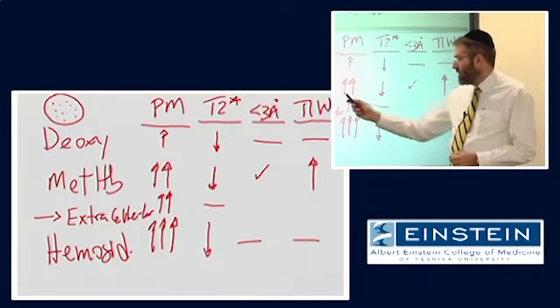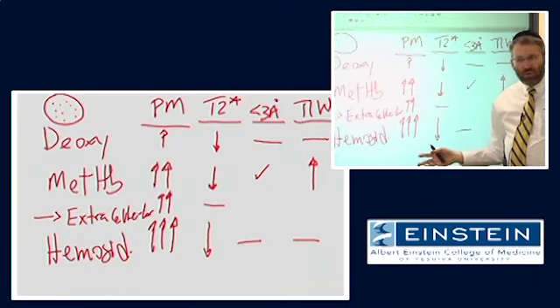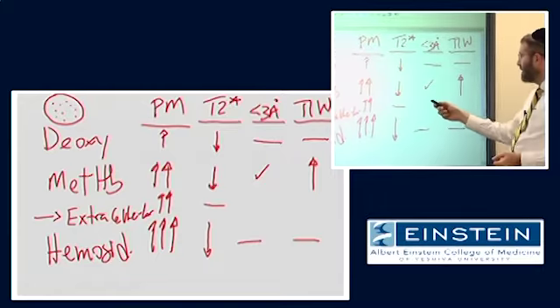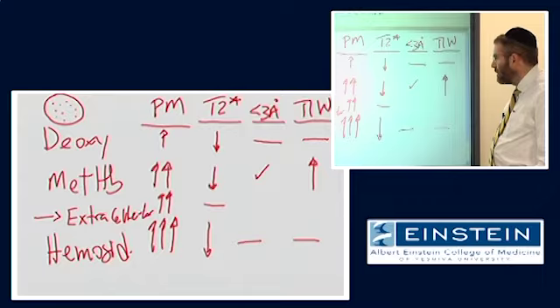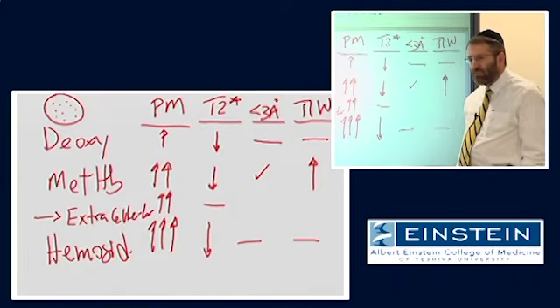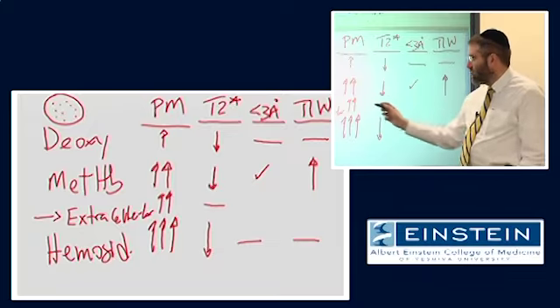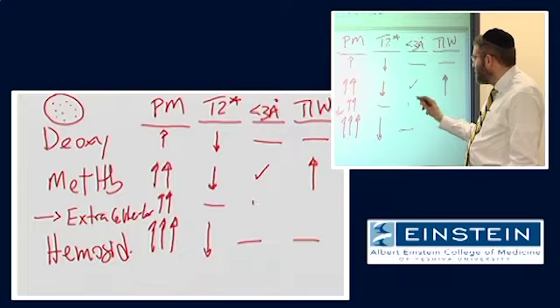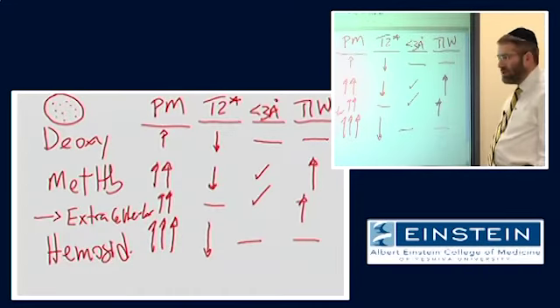Now, how does the fact that our red cells have let go of their membranes and had this methemoglobin diffuse through the tissue impact this 3 angstrom rule? Well, it doesn't really have any effect at all. Water protons can still get just as close to those iron atoms as they could before. So we still make this qualification, and we still have high signal on our T1 weighted image.